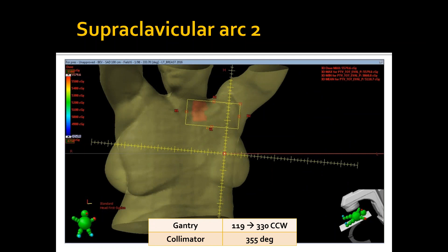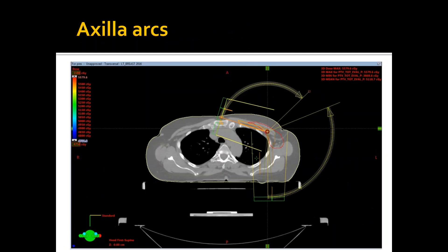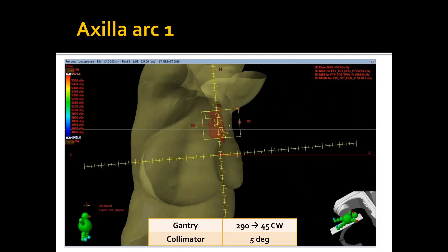These are my axilla arcs. As you can see, they're all partial arcs. I used two partial arcs here as well from 290 to 45 and from 179 to 70 counterclockwise.